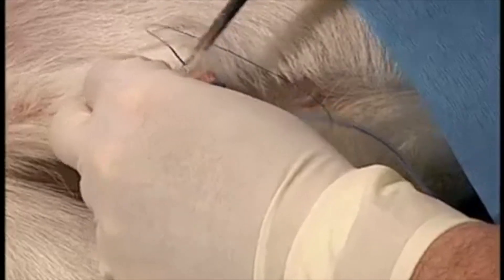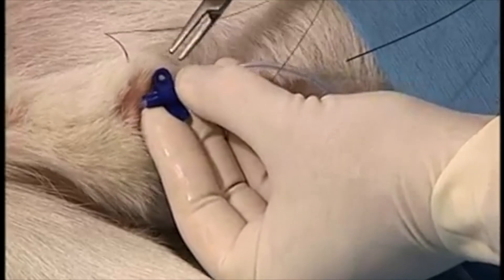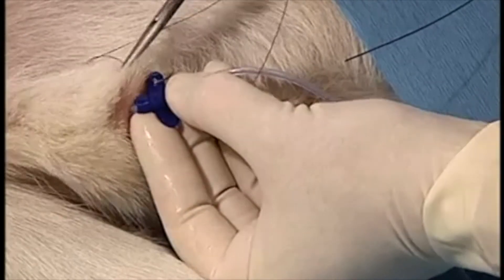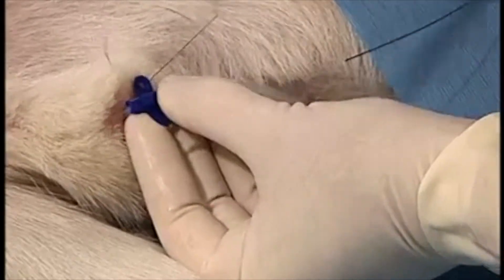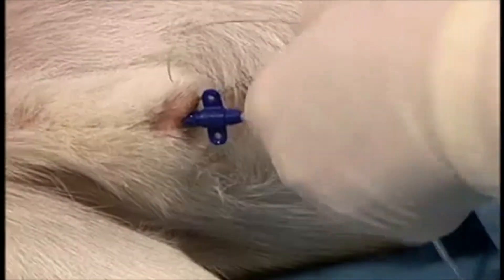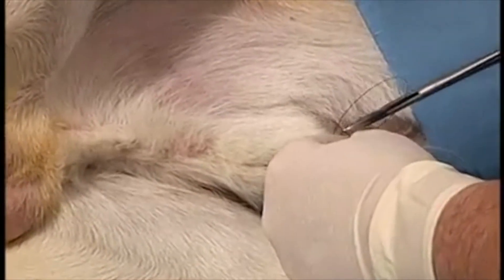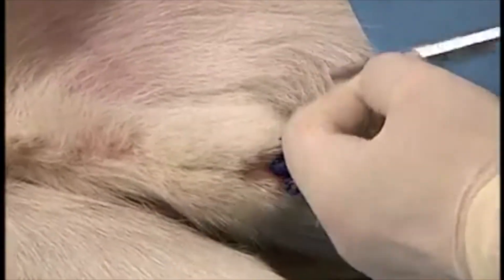The butterfly wing is then attached to the catheter at the level of the urethral orifice and sutured to the prepuce. The butterfly wing must also be sutured around the two suture grooves on either end to ensure that the butterfly wing does not slip off the catheter.